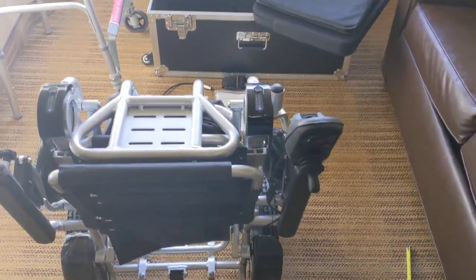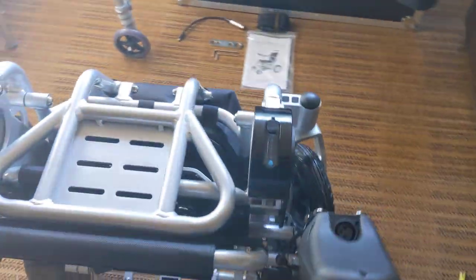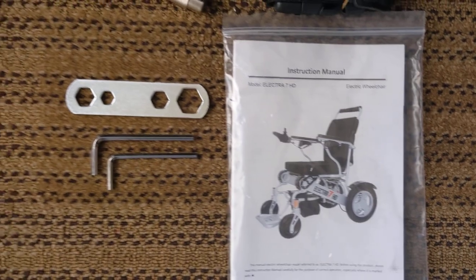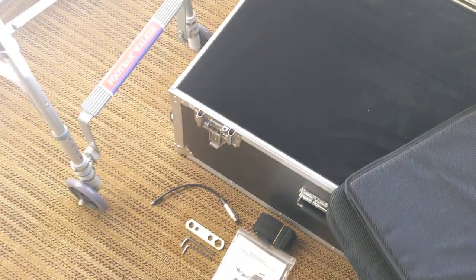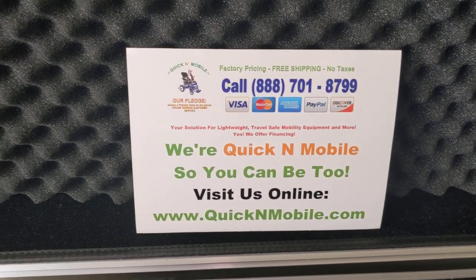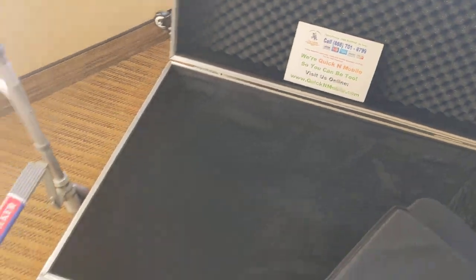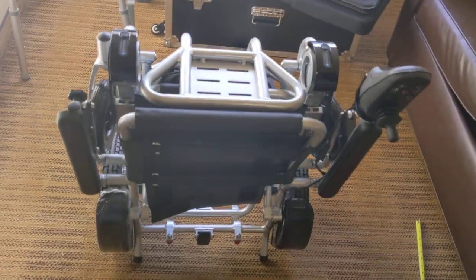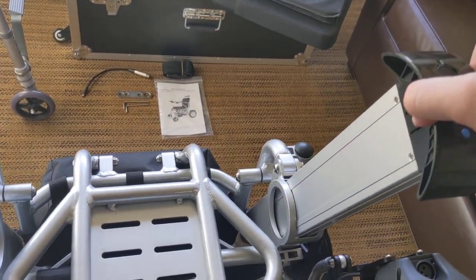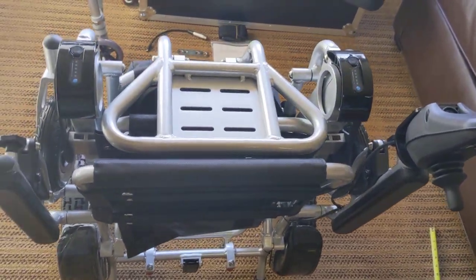Hello, this is Paul from QuickNMobile.com and I have a very exciting video about the 2021 Electra 7 Power Folding Wheelchair — all that comes with it and all of the different features of adjustability. The Electra 7 is a total of 50 pounds with no batteries, and it has two batteries that remove. It is an FAA travel compliant chair, and it is 58 pounds with both batteries.